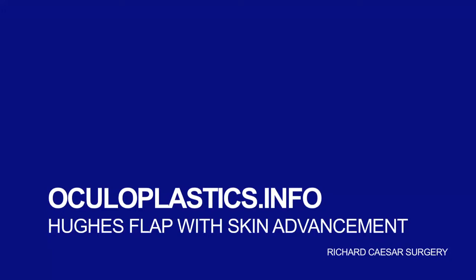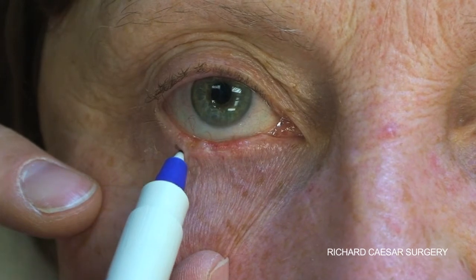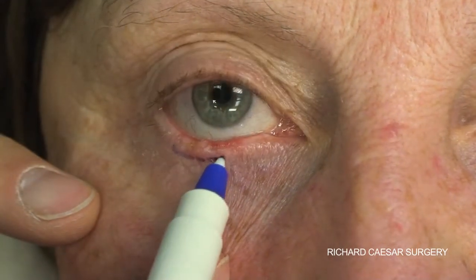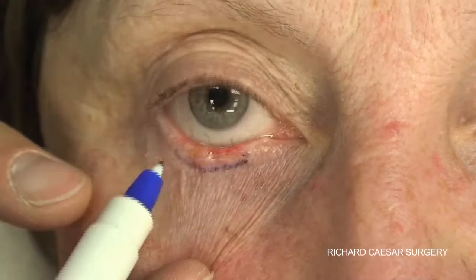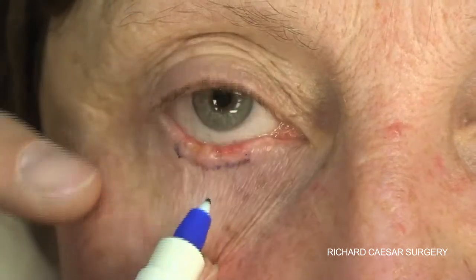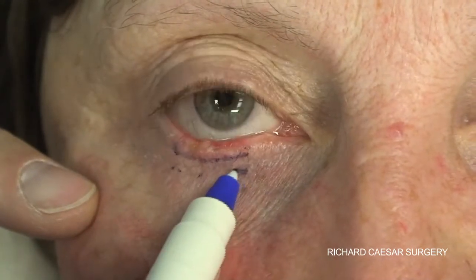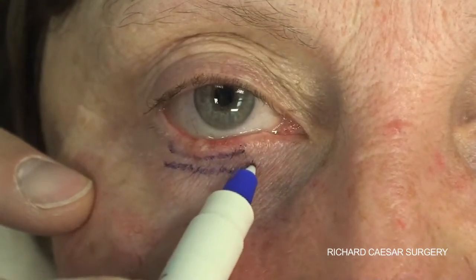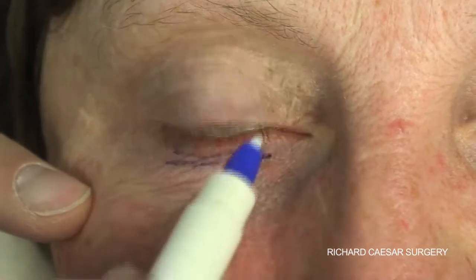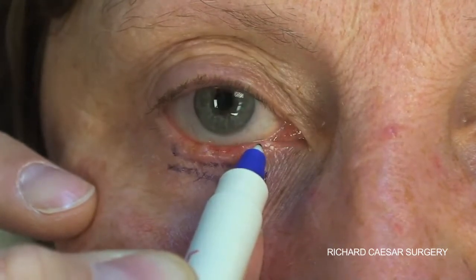The Hughes flap is a very versatile flap and can be used on a number of different depth defects. The key indicator to require the use of a Hughes flap is the horizontal extent of the lower lid lesion. In this video, we're using a different technique to the previous Hughes flap as the lesion is very shallow. Because the patient has some lax skin in the lower lid, rather than using the Hughes flap with a skin graft, it's possible to do the Hughes flap with an advancement of the skin onto the Hughes flap.